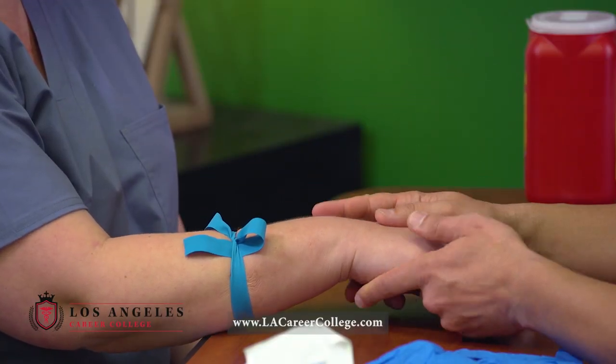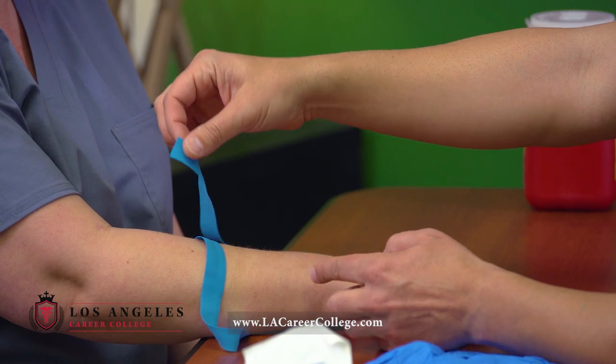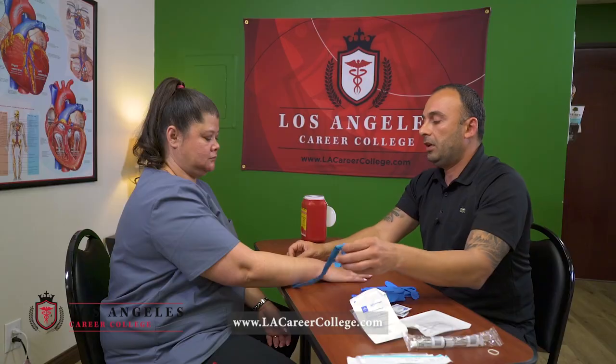Now that I have the tourniquet tightened, I'm gonna go and look for a vein. I do see a good one here, but I'm not gonna settle just yet. The tourniquet needs to be a quick release, obviously. We'll go ahead and try the other arm as well.